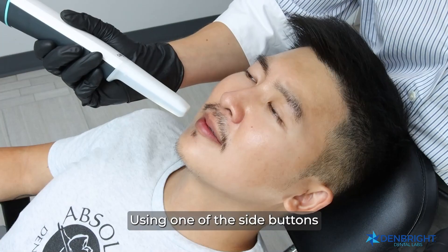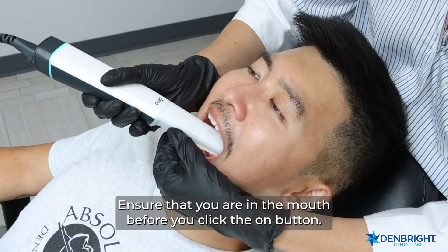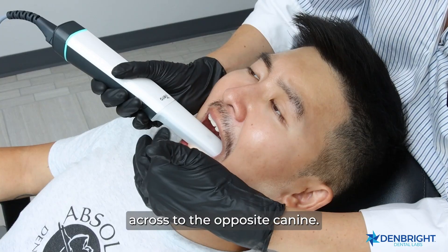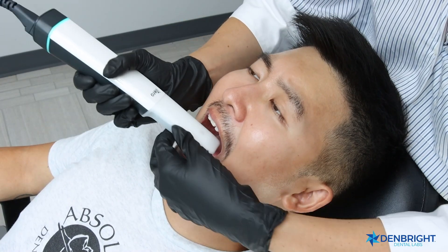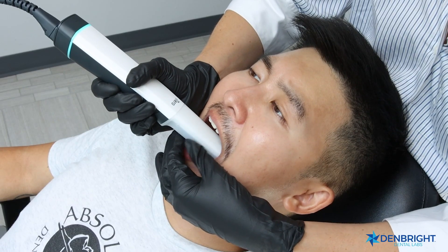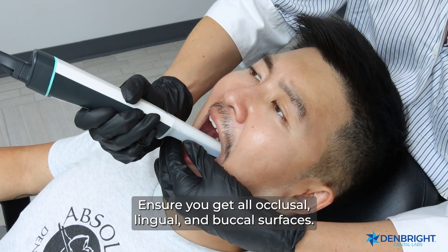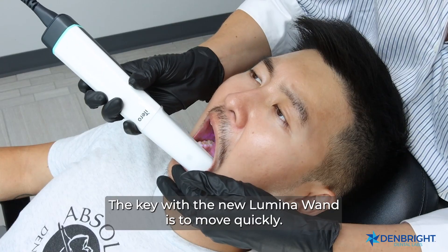Using one of the side buttons, you can start your scan. Ensure that you are in the mouth before clicking the on button, and ensure you are positioned across the mouth from one posterior molar to the opposite canine. Once ready, click the side button one time and move swiftly across the mouth — we do not want to over-scan. Ensure you get all occlusal, lingual, and buccal surfaces.